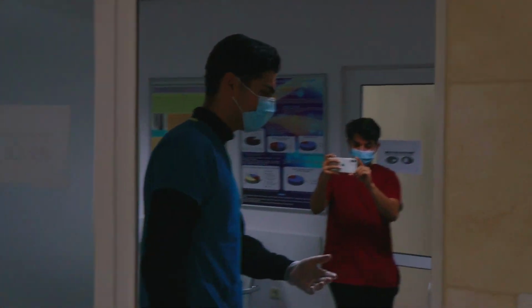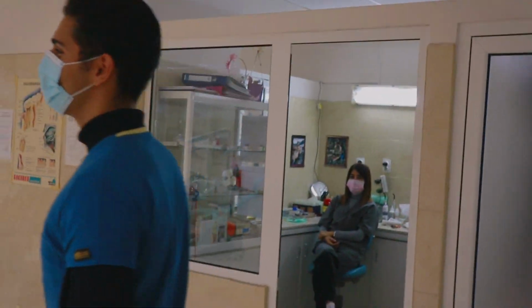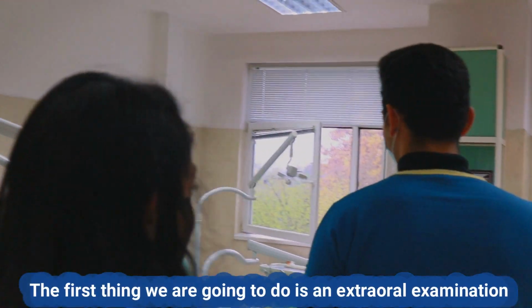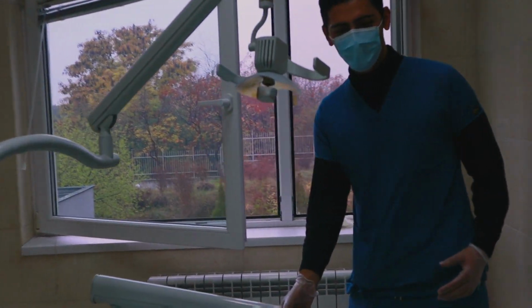Would you like to come in? The next step is getting to know the patient's personal details and a short briefing on what I'm about to do. The first thing we're going to do is an extraoral examination, and then after that we'll do an intraoral, and we'll see if you have any problems with your teeth.